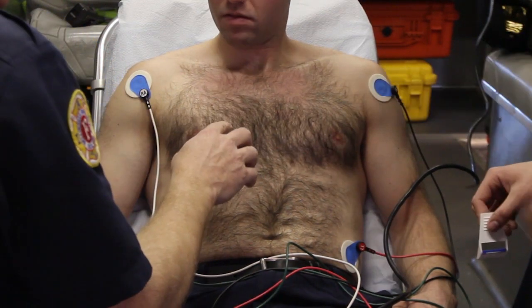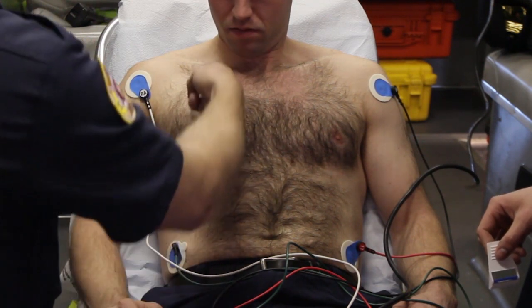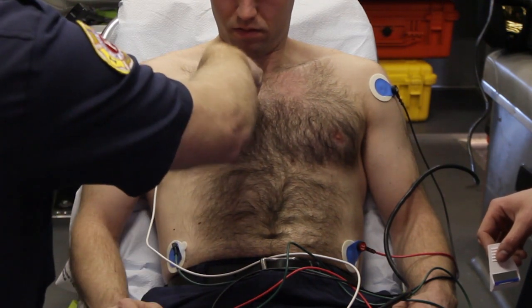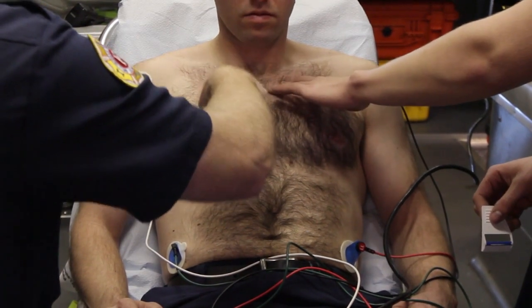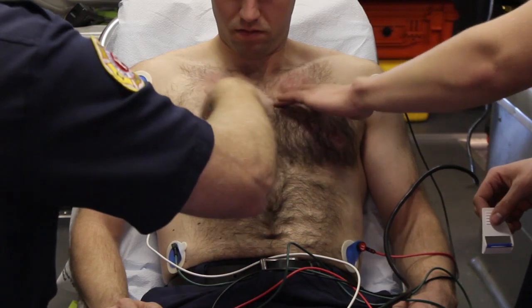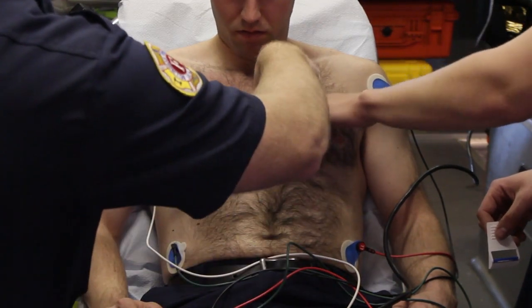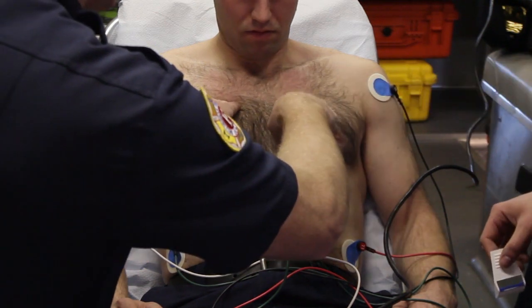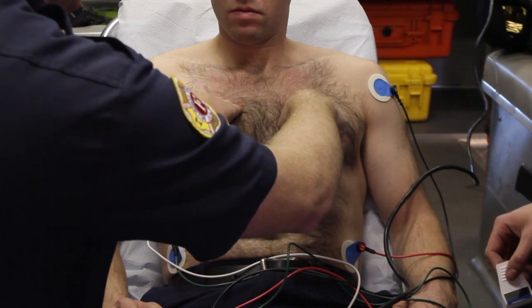It isn't always easy to feel, but if you're right at the mid-clavicular line and you feel the first real one you can dip into, that's going to be your second intercostal space, then third, and then fourth. And when you get to the fourth, you're just going to want to get those two put on either side in that void in the fourth intercostal space, which should be right there on both of them.